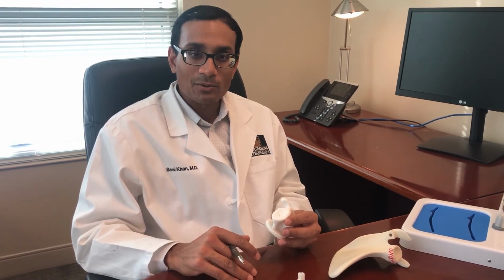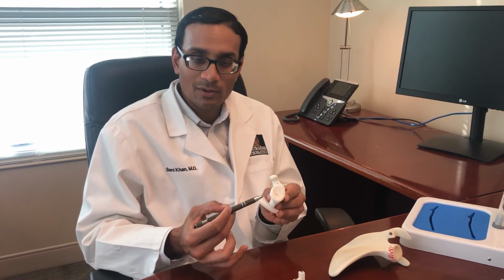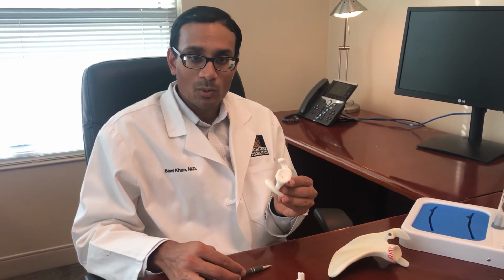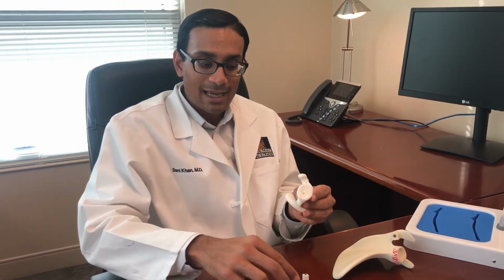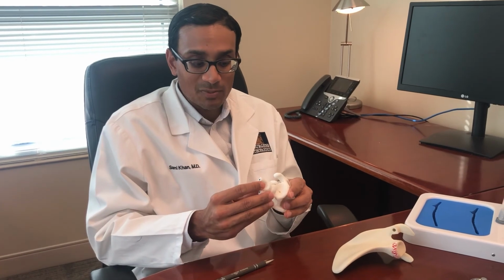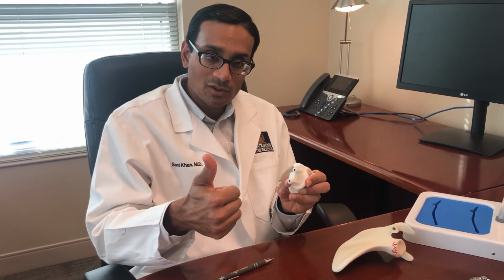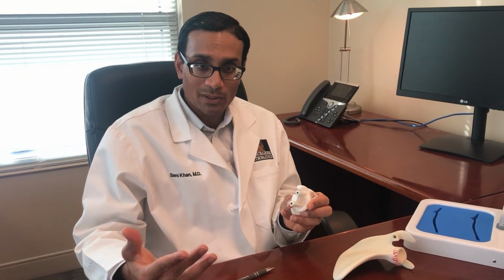Secondly, we are now getting CT scans and a three-dimensional picture of someone's shoulder socket prior to surgery. When we do the surgery, we basically preserve as much bone, and we have guides that are created specific for the patient's shoulder. This preserves the patient's bone, it makes the surgery more accurate, and I think it's going to add to the longevity of the shoulder implant.